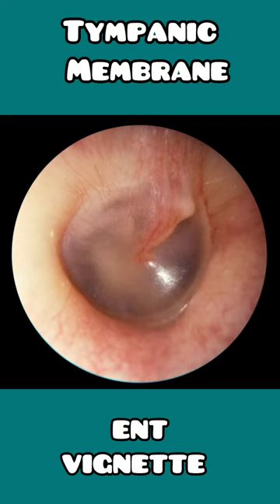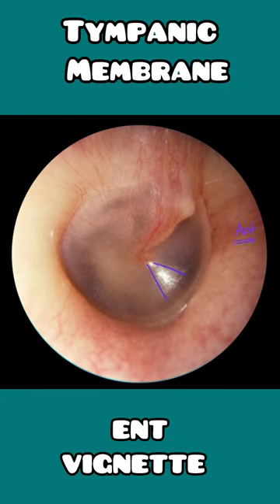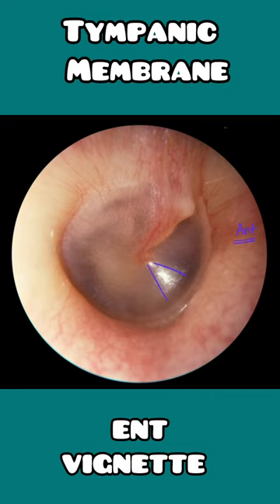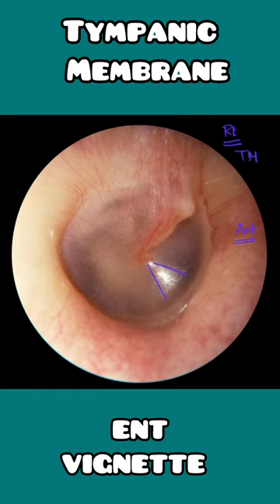In this video, let's review the anatomy of the tympanic membrane as we can see through our otoscope. You can see this is the cone of light, and the cone of light represents the anterior of the ear. If this part is the anterior, then we can say that this is a right-sided tympanic membrane.